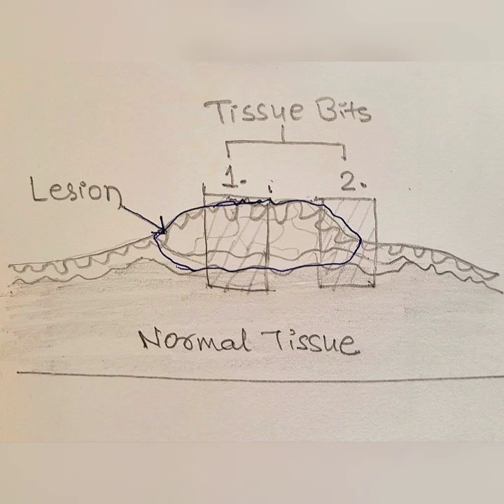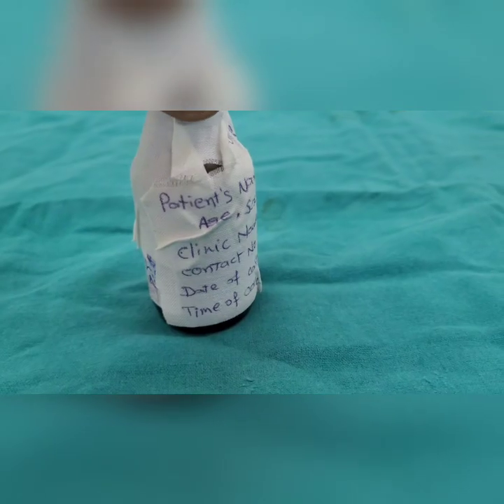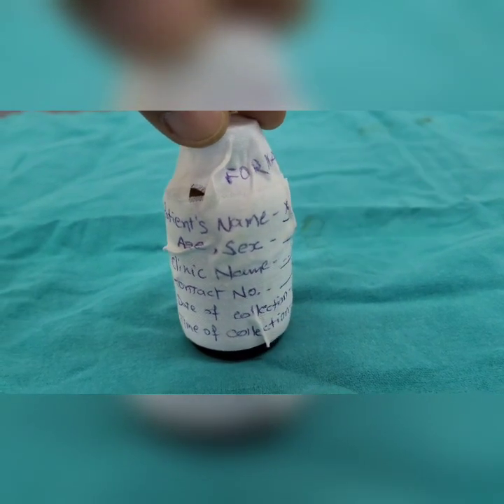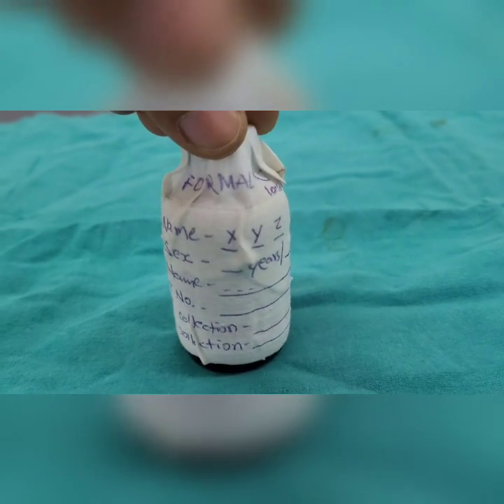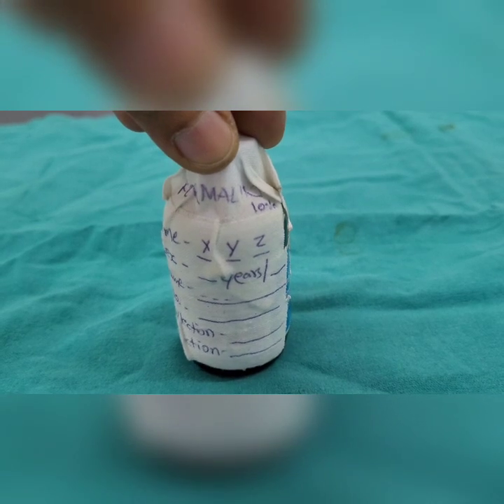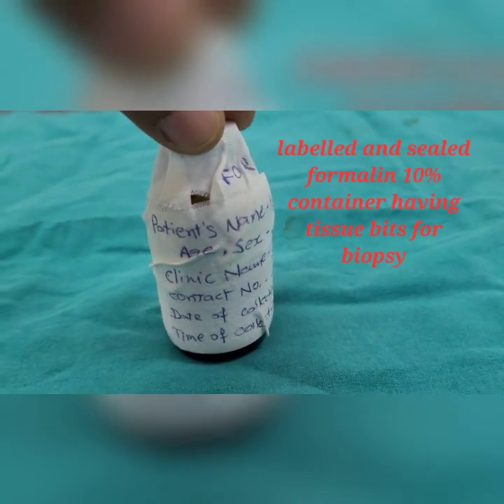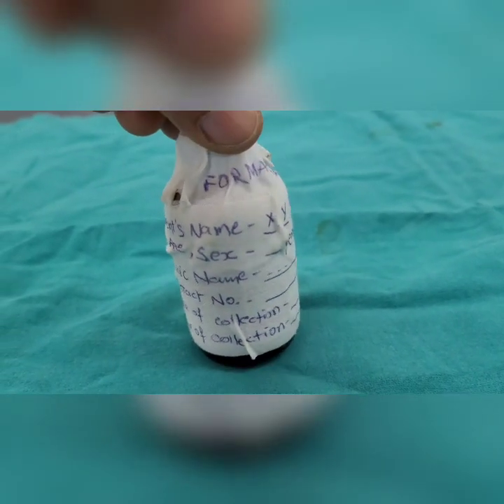tissue layers. Now the next important point is to transfer them into a leak-proof container having formalin 10% solution as a tissue fixative. The minimum volume of the formalin should be 15 to 20 times the volume of the tissue beds. Label the container with the patient's complete demographic data, clinic or hospital name and contact number, and the date as well as time of the biopsy taken.